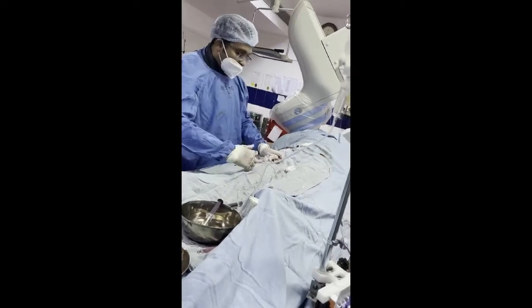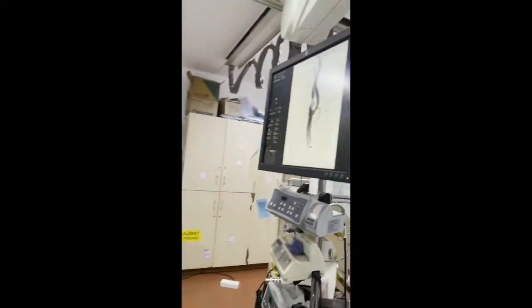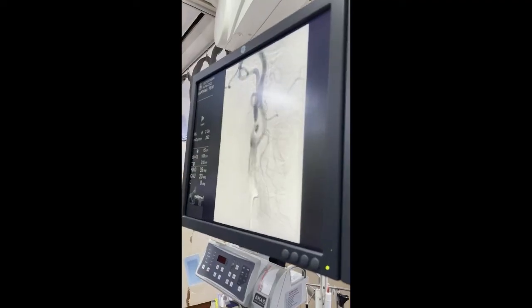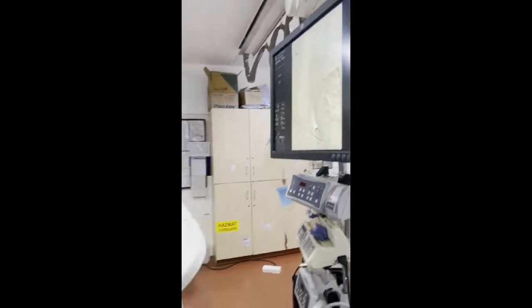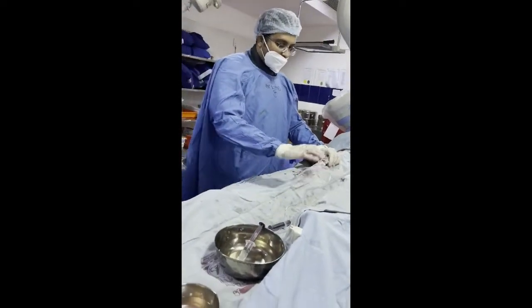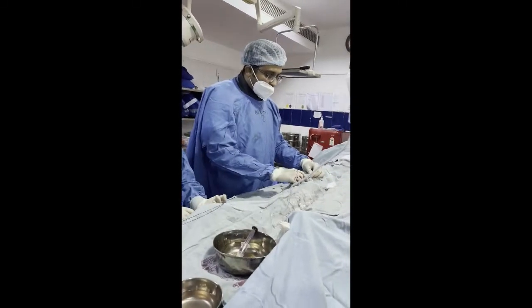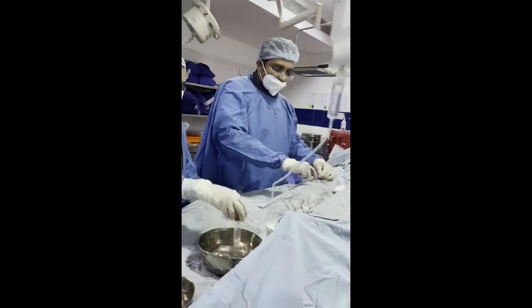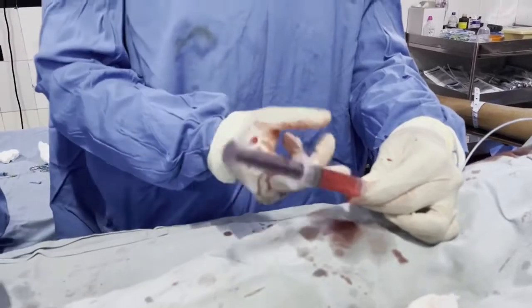Now I am taking different views and giving a few check injections. Check injections are just to see whether the position is right — whether the different positions I am planning to take do not have any overlap before the actual DSA is taken. So we have a fluoro image and then a DSA image.